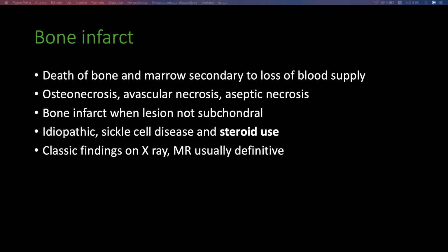Many patients have no predisposing factors, and infarcts may be considered idiopathic. Predisposing factors include sickle cell disease and steroid use, which was the case of our patient, because she was a kidney transplant patient. She has to be on prednisone. And the findings on the X-ray are classic. But the MR is usually what gives us the definitive diagnosis. It can frequently mimic other diseases, but the MR gives us the differences.